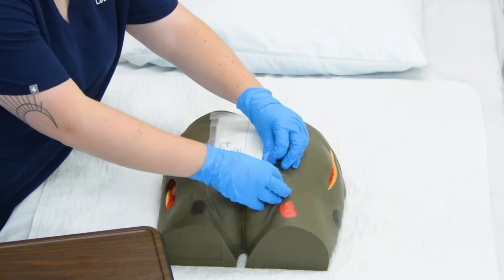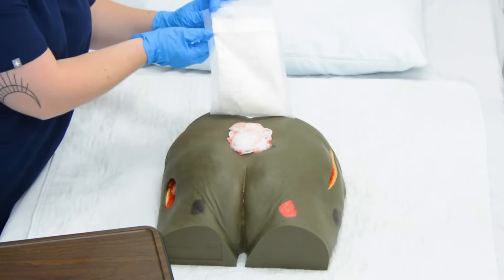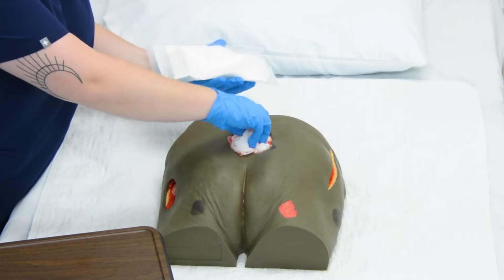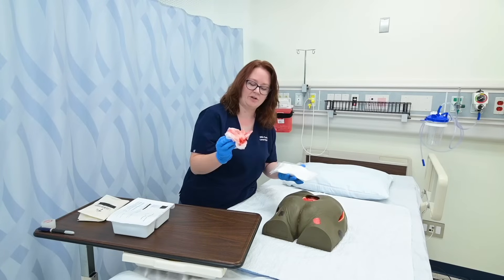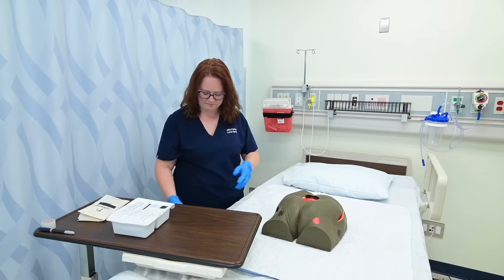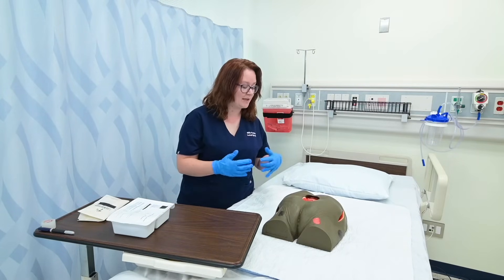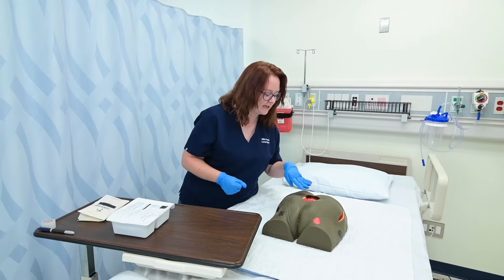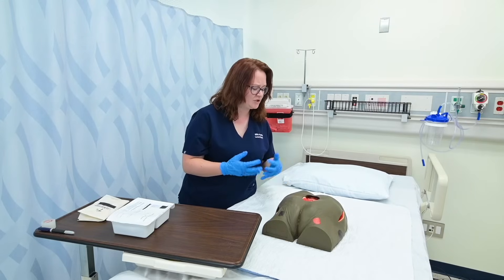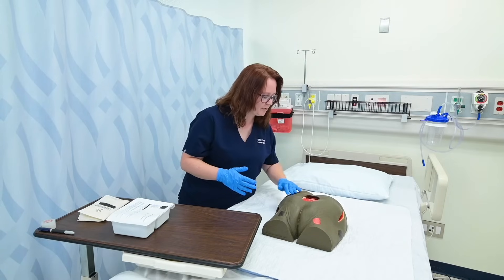I simply remove the top dressing, which in this case is an ABD pad. I like to hold it and take out all the inside dressing, and I'm going to take a look at it and throw all of that away appropriately. While I'm doing all that, I'm assessing the type of drainage, the color, the texture, the amount. I'm looking at the wound itself, checking out the bed, seeing what type of tissue is available — how much drainage is present, what color, if it smells bad. I'm looking at the edge of my wound.